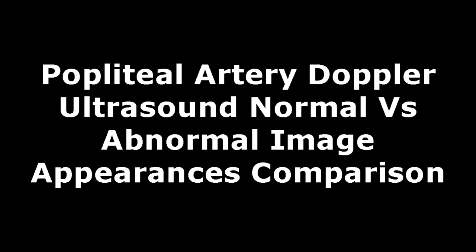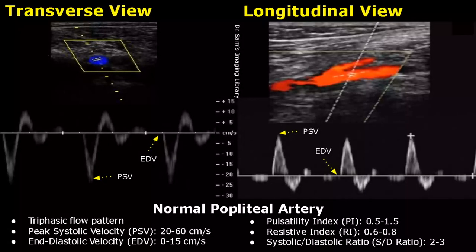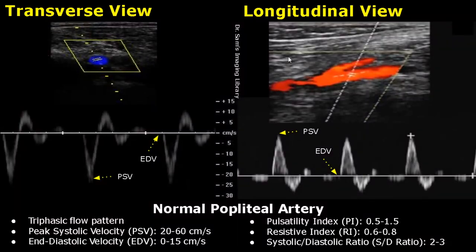Hello everyone, this is Dr. Sam and this video is about Popliteal Artery Doppler Ultrasound. These are transverse and longitudinal images of a normal popliteal artery. The normal spectral Doppler waveforms are also given. Normally, the popliteal artery has a triphasic flow pattern.